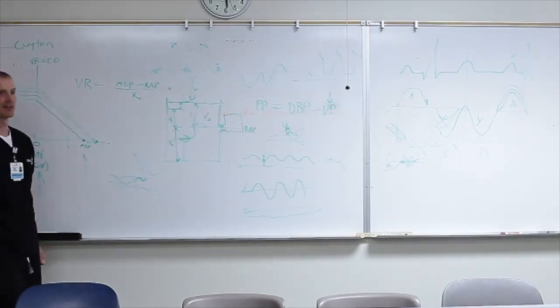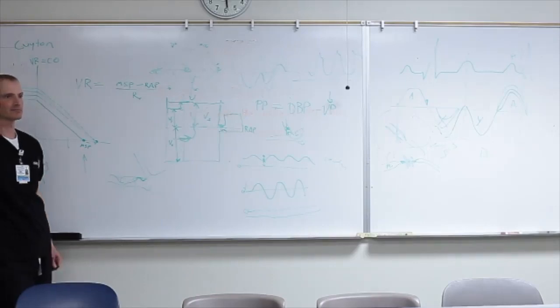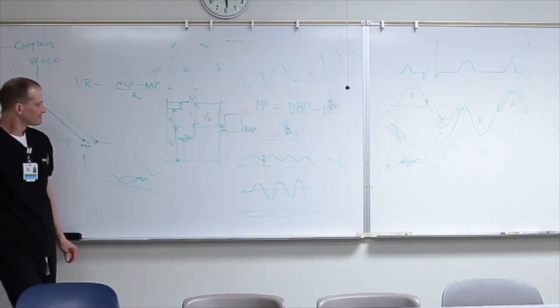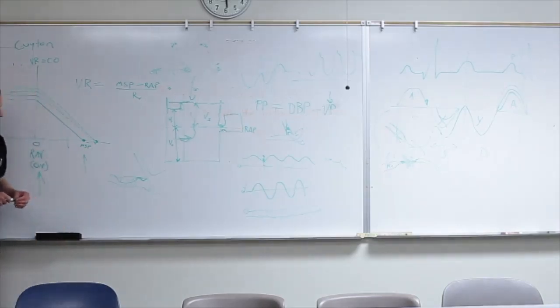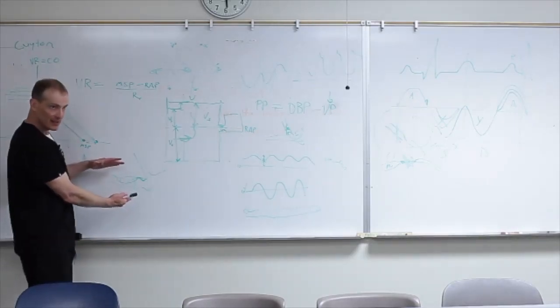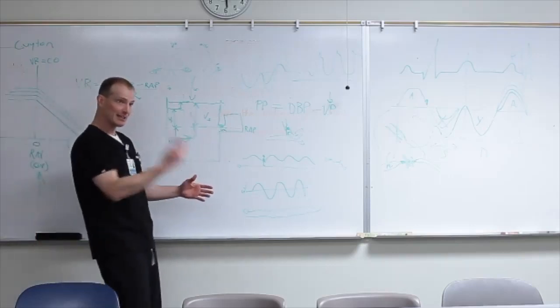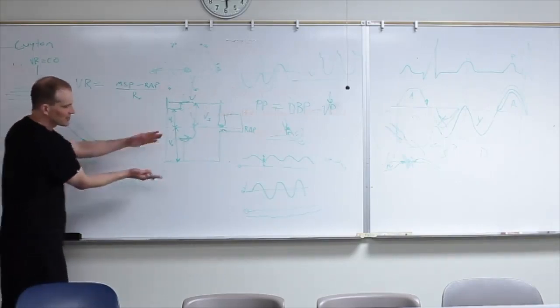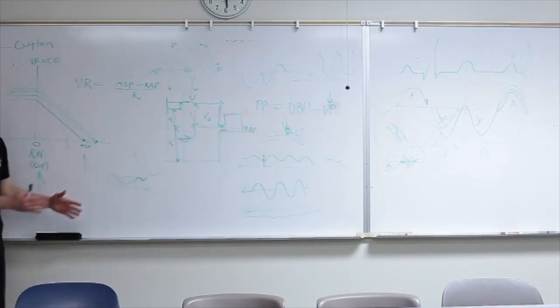Could, if you have high right atrial pressures, it collapse less there at the point of entry if the IVC was truly empty, where it would collapse more a little further back? What's happening is really complicated. You have intra-abdominal pressures affecting it, intrathoracic pressures maybe pulling it in at certain respiratory phases, and then you've got the cardiac cycle dealing with it as well. So a lot of times you have this undulating thing doing all things, and you just got to see enough of these to get a good gestalt about what's going on.